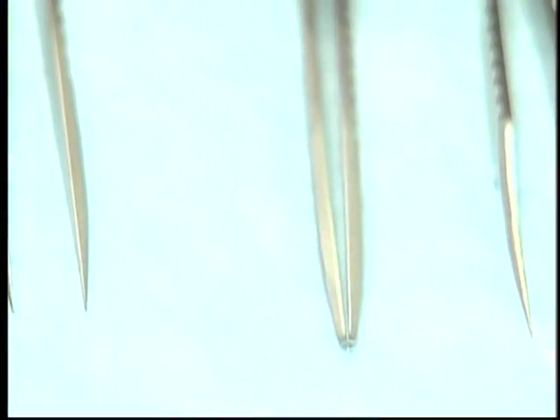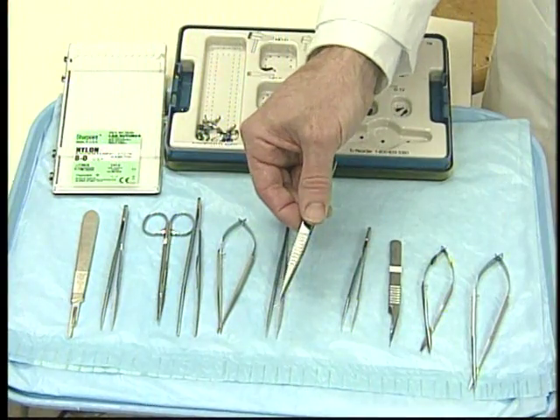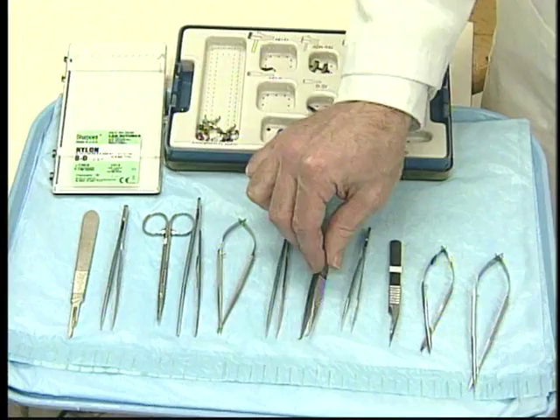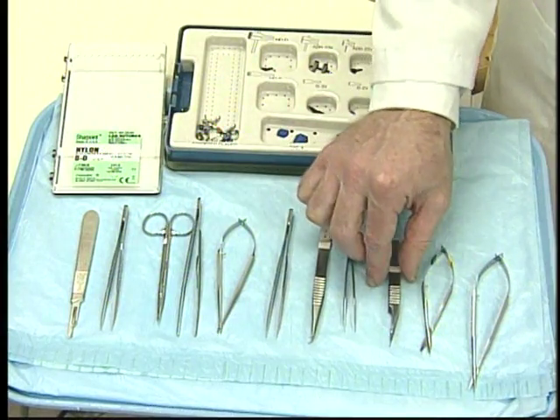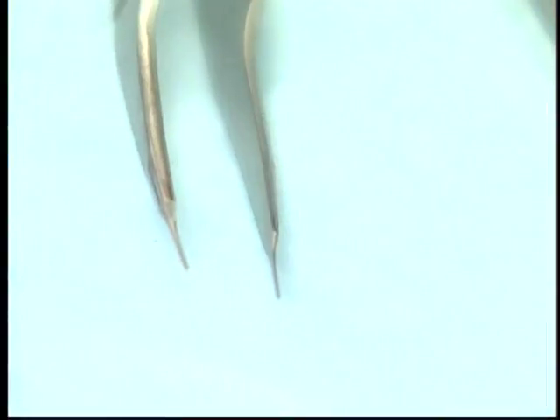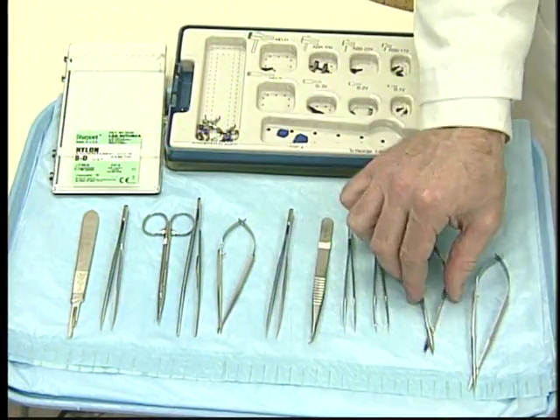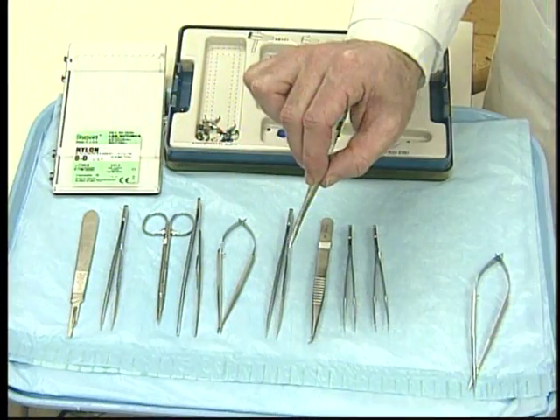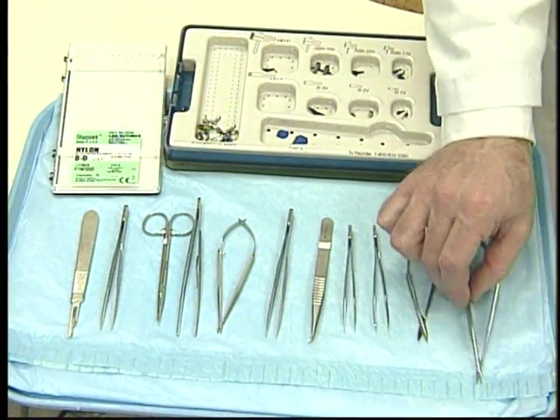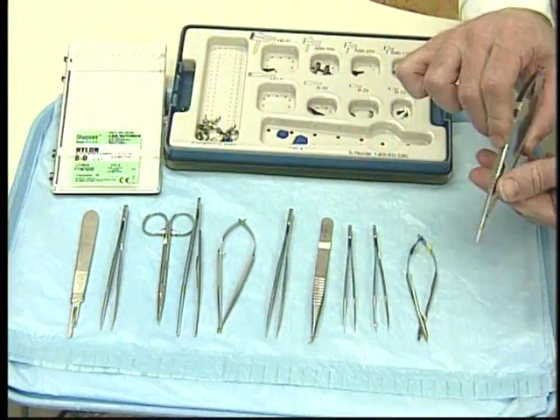Next is a curved jeweler's forceps that can be used as well as for a needle holder. Next is a fine jeweler's forceps, a number 5, for fine picking up of material. This is a vessel dilator with very thin points that are blunt on the tips. This is a dissecting scissors used for tissue dissection. And finally, a pair of adventitious scissors used for cleaning off the adventitia from vessels.